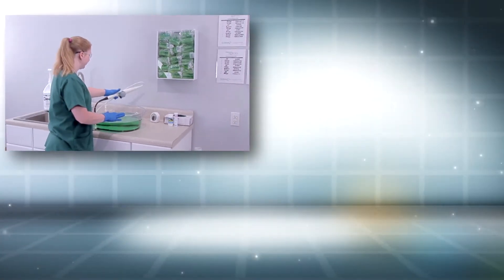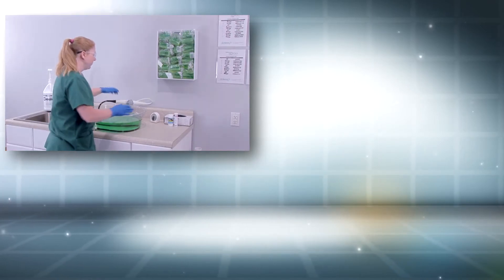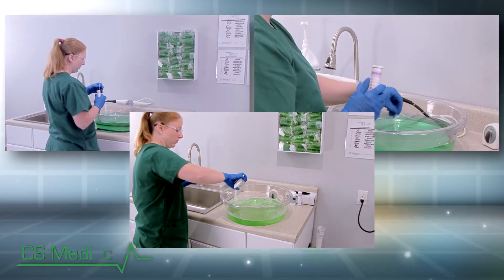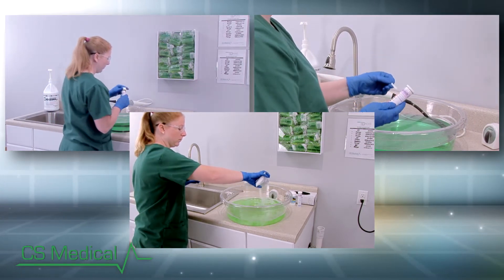The TD100 operating principle is similar to many flexible endoscope reprocessors currently available on today's market. The TD100 provides for fast, consistent turnaround while reducing stress on the probe and increasing staff efficiency. CS Medical's TD100 effectively addresses and eliminates many manual reprocessing issues without sacrificing the disinfection of your TEE probe.